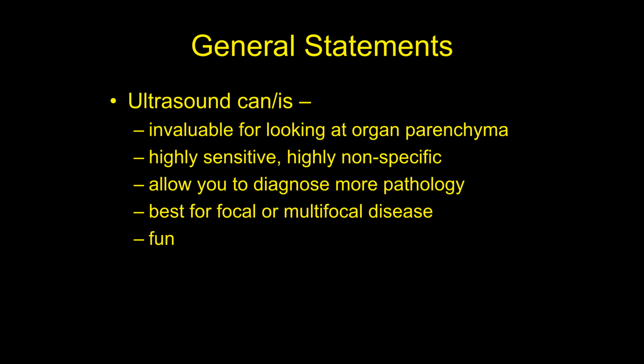If you have ultrasound and you know how to do the ultrasound, that's the key. It will allow you to diagnose more pathology than if you don't. In other words, if you have radiographs and you see the liver is big, you've got your differentials for why the liver would be big and rounded in appearance, which we talked about already. But really, without looking inside the liver, I can't be more specific, and I can't diagnose and define a mass just with an X-ray. So ultrasound will allow you to diagnose more pathology.